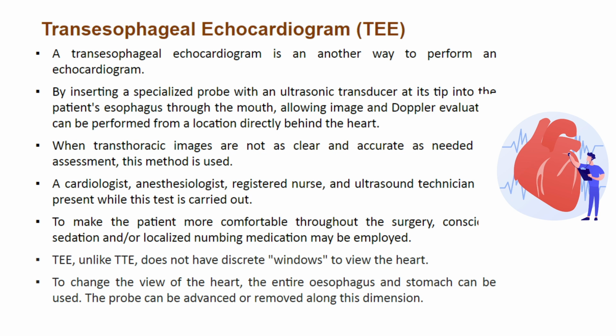A cardiologist, anesthesiologist, registered nurse and ultrasound technician are present while this test is carried out. To make the patient more comfortable throughout the procedure, conscious sedation and or localized numbing medication may be employed.